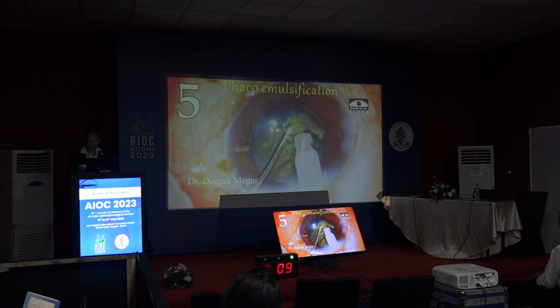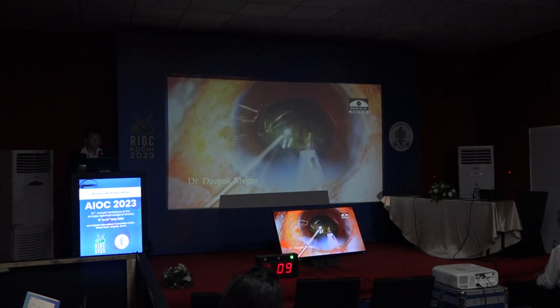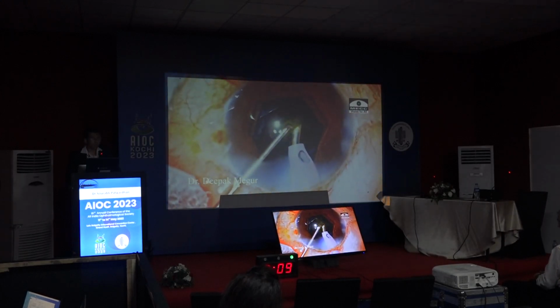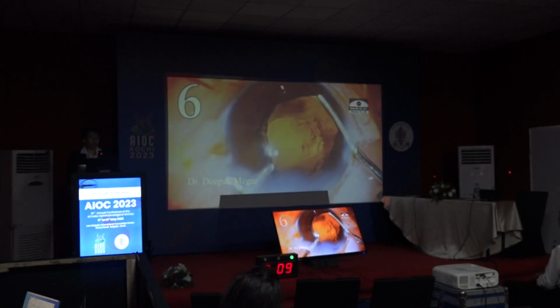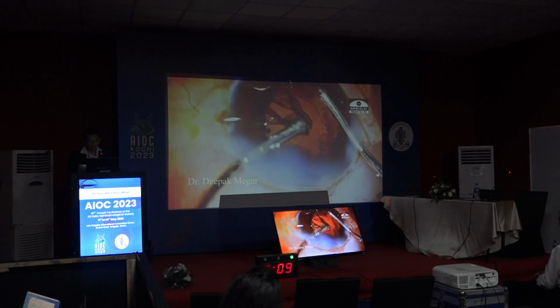And then obviously the phacoemulsification. Usually these patients are elderly, so the nucleus will be dense. You will have to have a very controlled way of managing this nucleus. The nucleus division technique of your choice will do the job, but the only thing is you need to ensure that you're in good control. Cortex aspiration with the presence of a CTR can be challenging, but if you use the tangential method of stripping, it is not going to be a major issue at all.